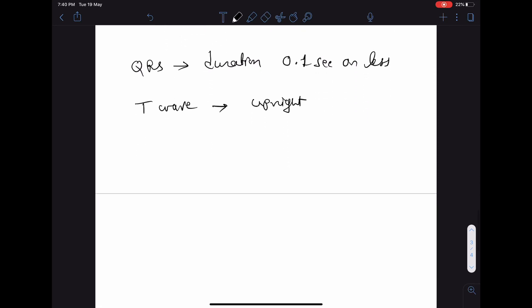Now coming to the PR interval. The normal duration of PR interval is from 0.12 second to 0.2 second. There are conditions where PR interval becomes shortened, or there are other conditions where PR interval becomes widened.